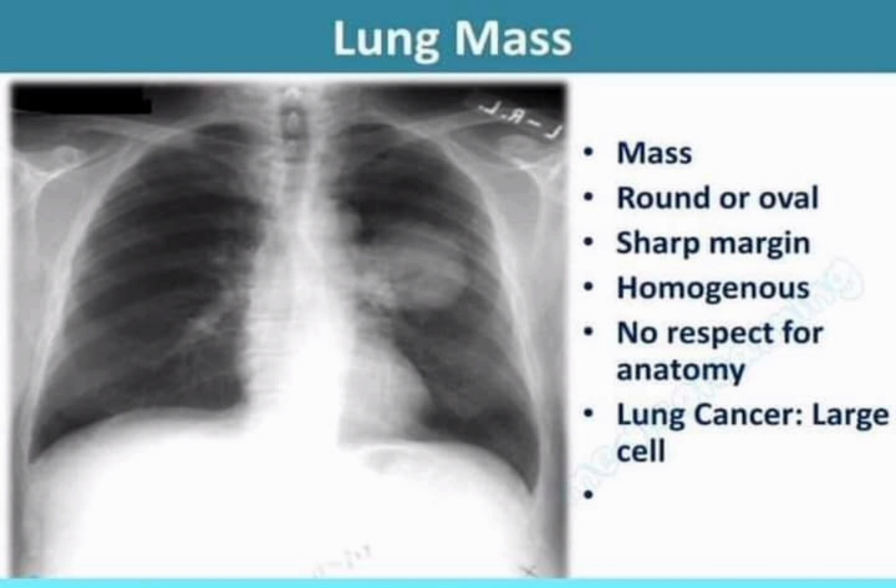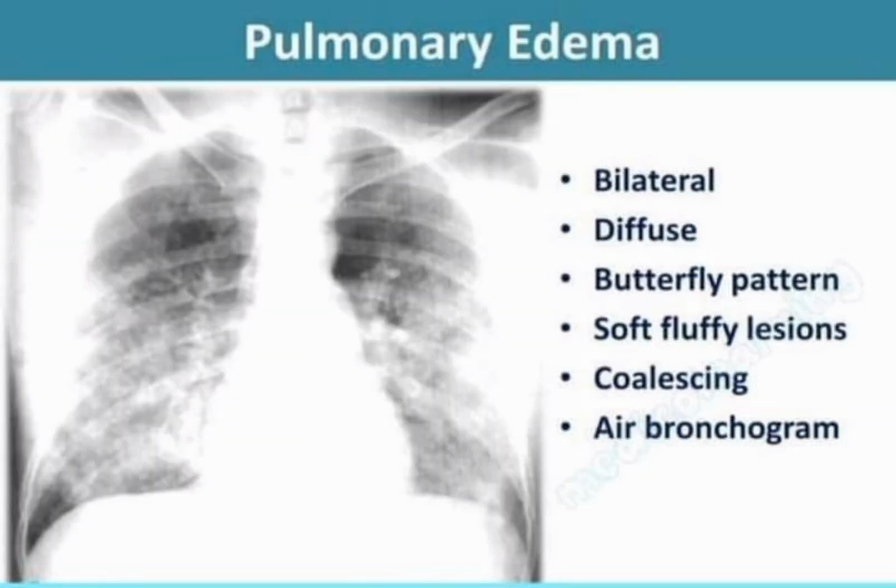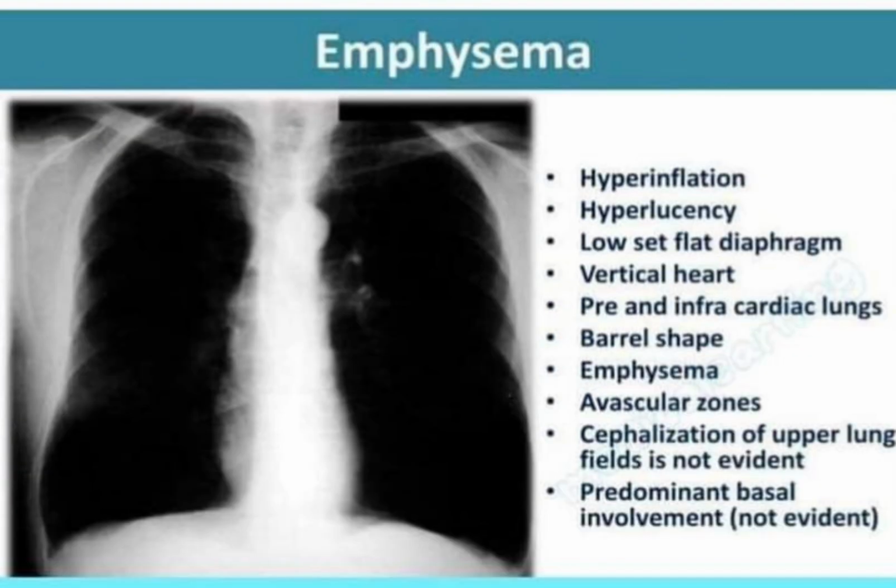A pacemaker, defibrillator or catheter. Pacemakers and defibrillators have wires attached to your heart to help control your heart rate and rhythm. Catheters are small tubes used to deliver medications or for dialysis. A chest X-ray usually is taken after placement of such medical devices to make sure everything is positioned correctly.